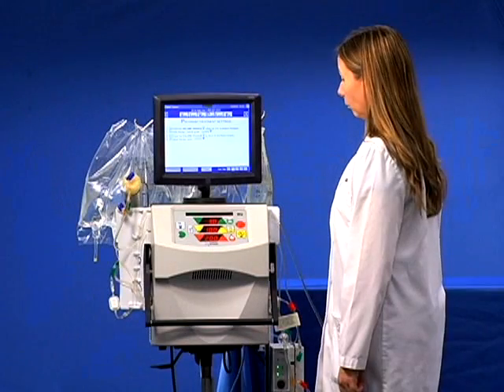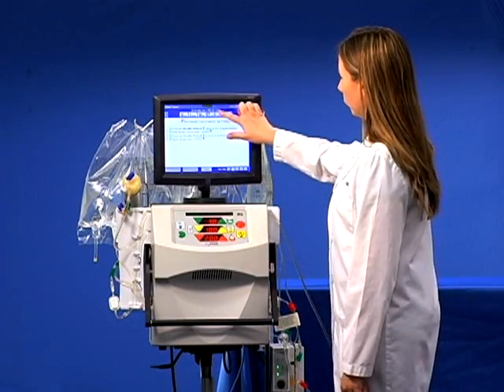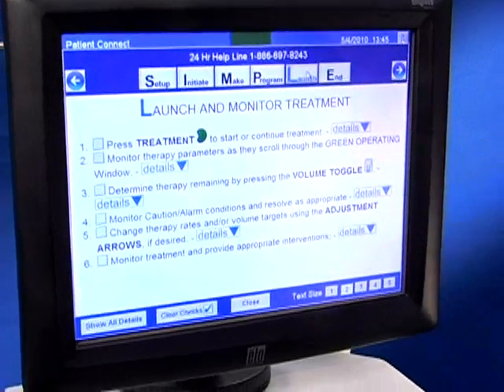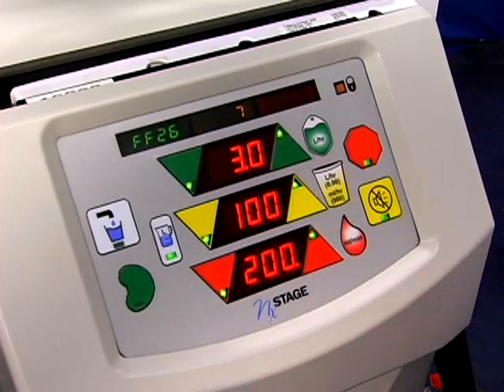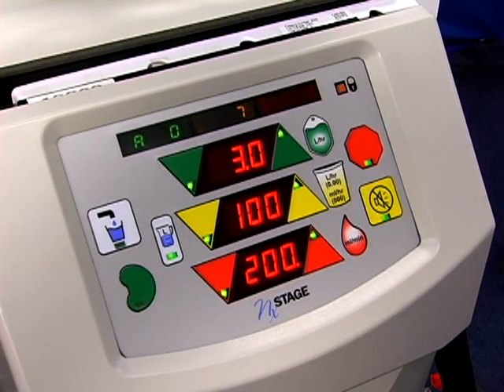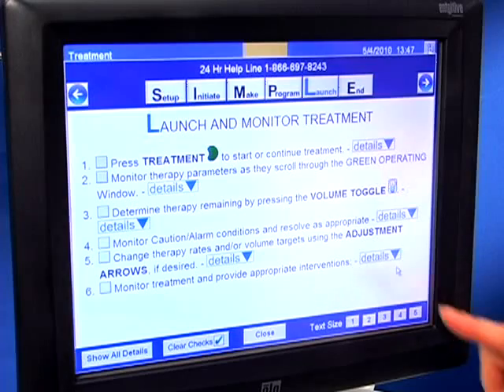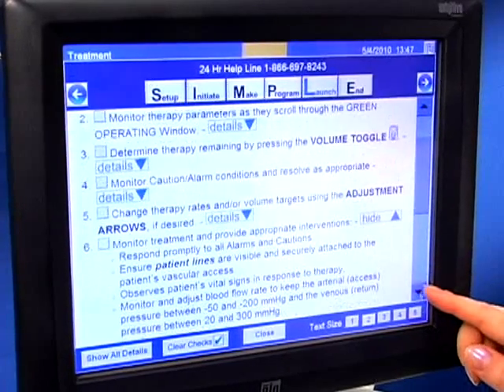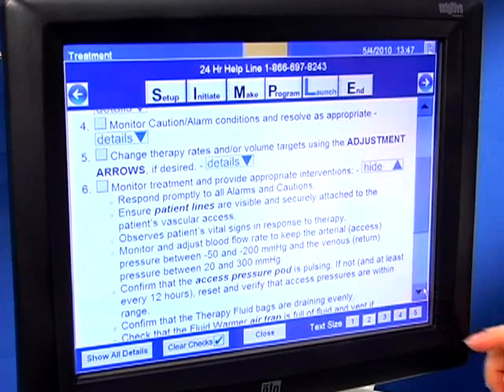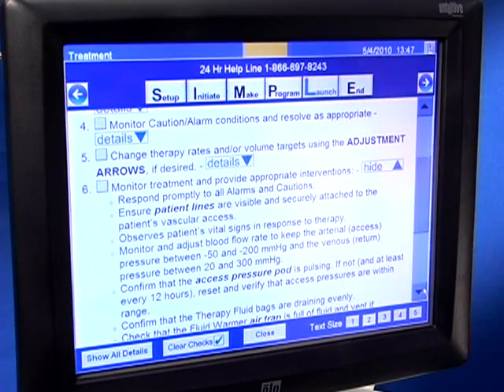Click on the launch button to learn how to start the therapy. Press the treatment key to start the treatment. Congratulations, you have successfully started the therapy. Refer to the detail buttons in One View for more information on monitoring the treatment. Monitor the treatment and provide appropriate interventions if necessary as outlined by your hospital protocol.